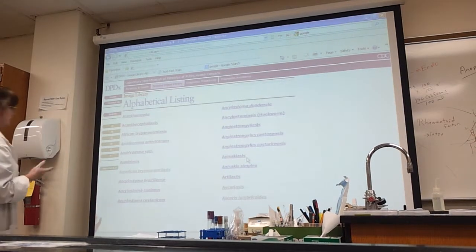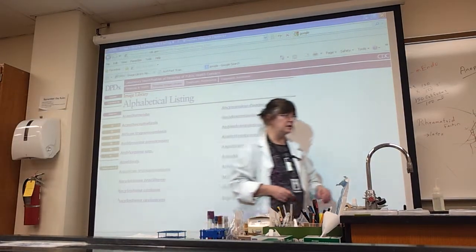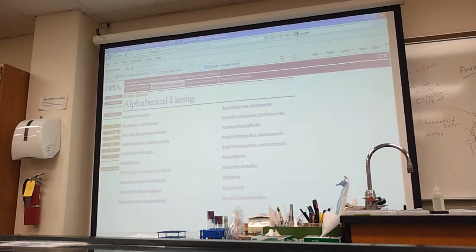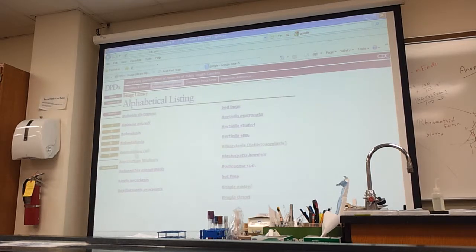Okay? Let's go for Balantidium now. These are the ones you really need to know the slides of, some of them, I'm not saying all of them. There's Balantidium coli right there. Balantidium. I'm sort of shortening it up.